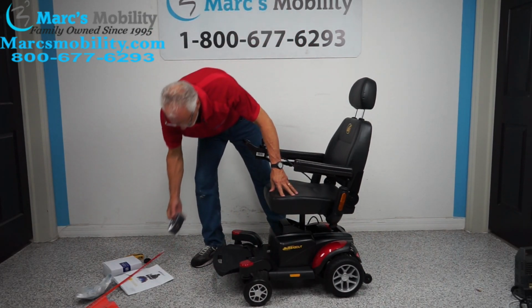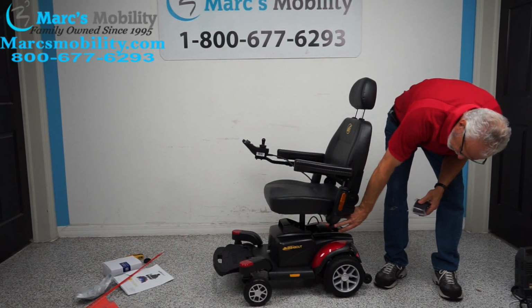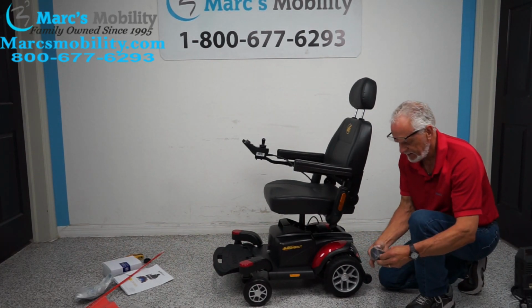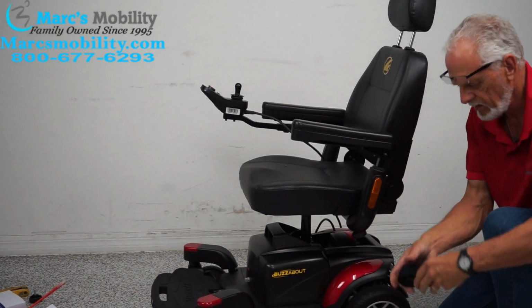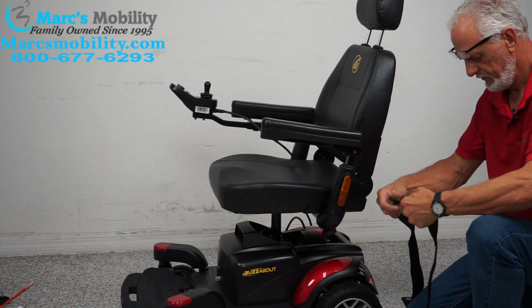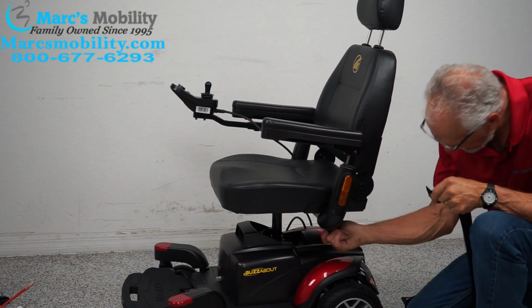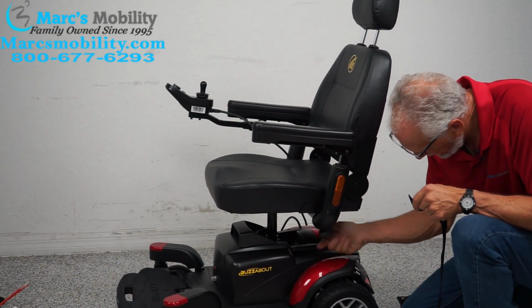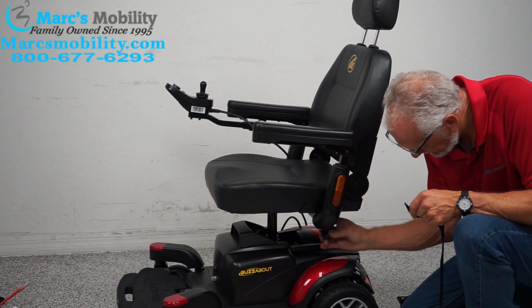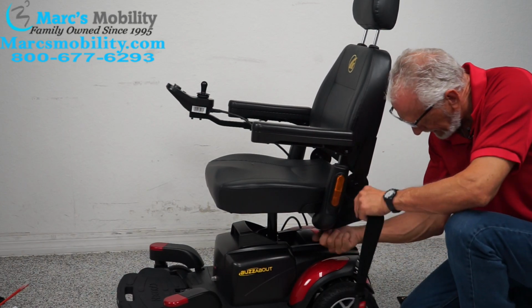By the way, folks, if you're going to put the safety belt on, the safety belt goes on the two screws right here. As a matter of fact, let me do it now so you can see it. I should have done it earlier. There's your safety belt. Okay, so you can see you have a loop, a hole right there. So you take this knob out of here, and run it through the knob back in the arm.